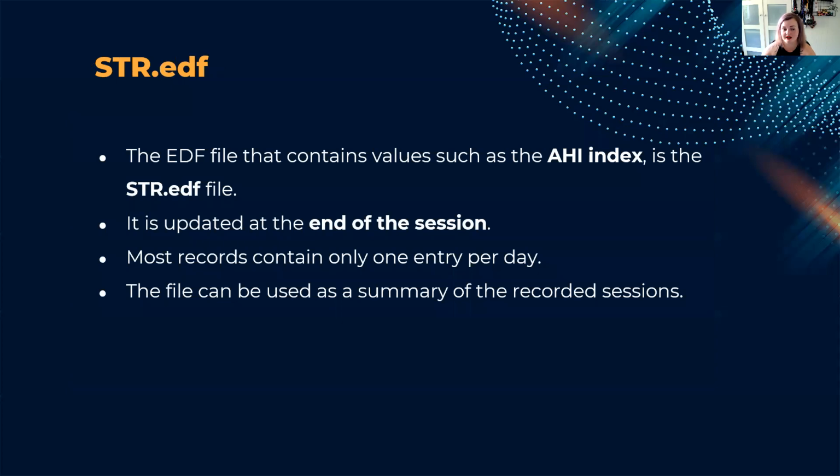Now, STR.edf was another one that was very interesting. This is the file that contains the values for the AHI index. And as I said earlier, this is a very important thing because we want to know what the overall sleep health of a patient potentially is. And the way that we know that is by looking at the STR.edf file.